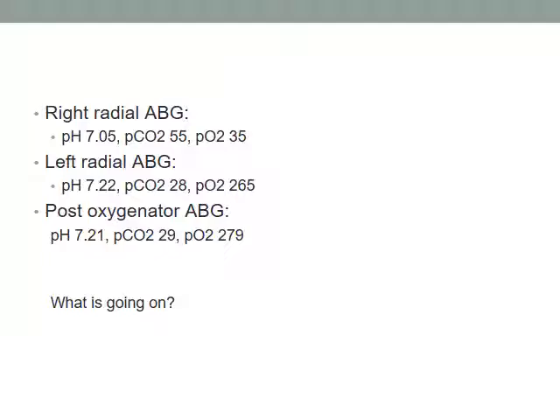Left radial looks like the oxygenator. What's going on? Lungs are cracked. That's the official diagnosis from the second row, and I would concur with that diagnosis. Yeah, lungs are cracked.